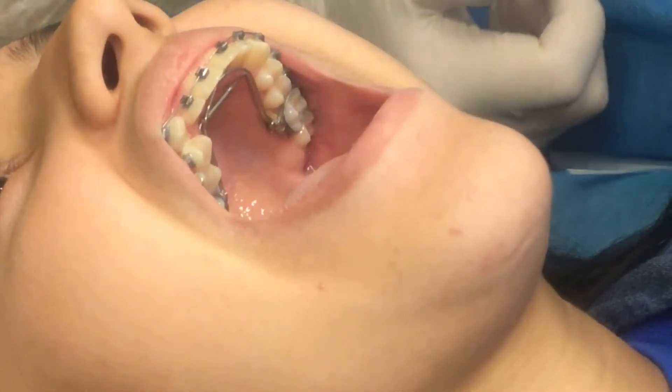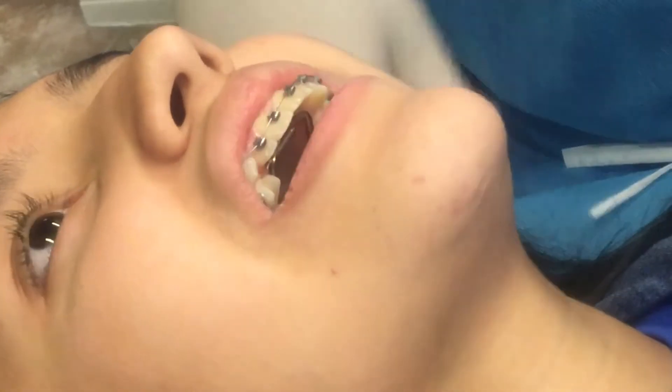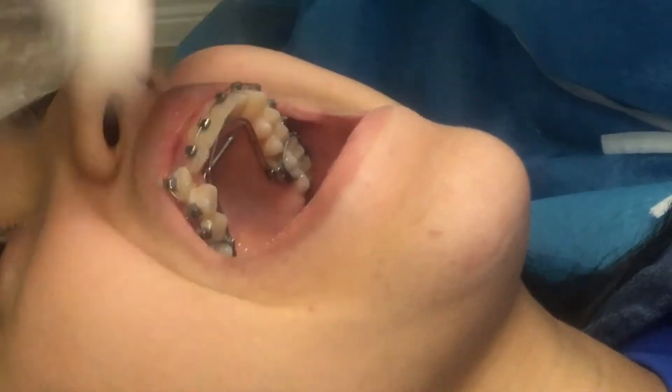Maybe not enough for her to feel it. Do you feel any pressure on there yet? Not really. So that's good — it's not painful. But it is putting a little more pressure.